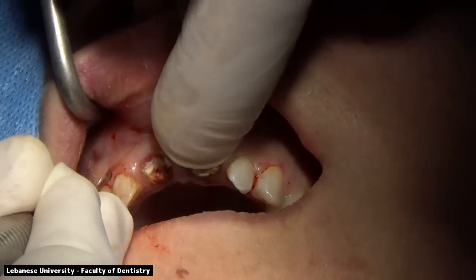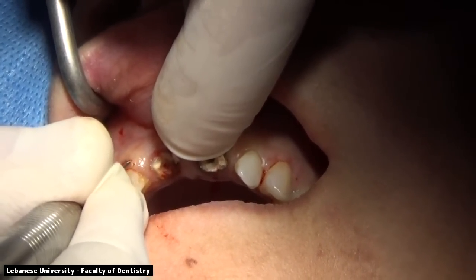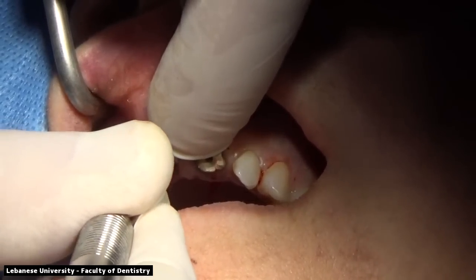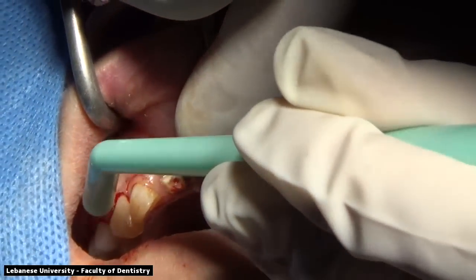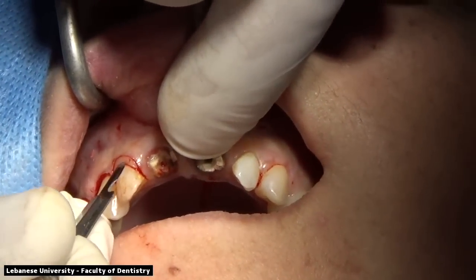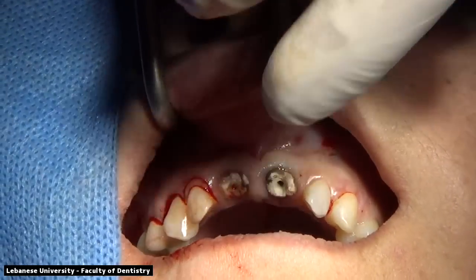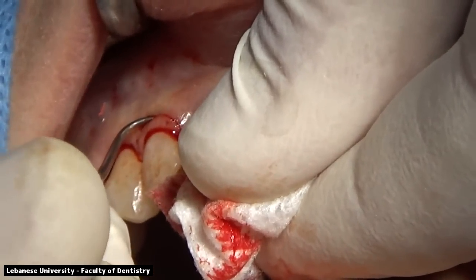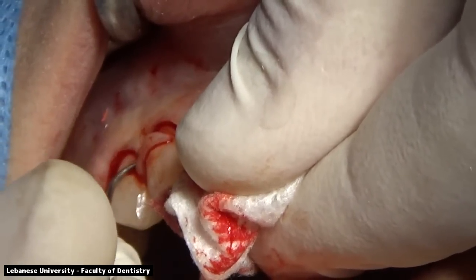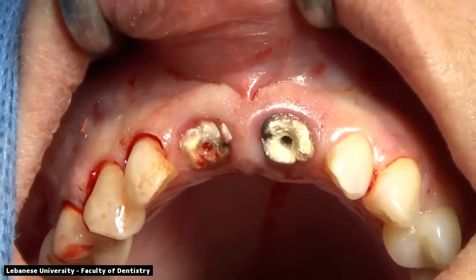We're going into the beveled incision on the lateral incisor. You can appreciate the wide and horizontal margins that are being created, all the way to the points which we created with the bone sounding procedure. The excision is done already with a clean cut.